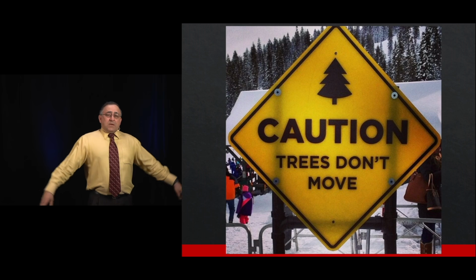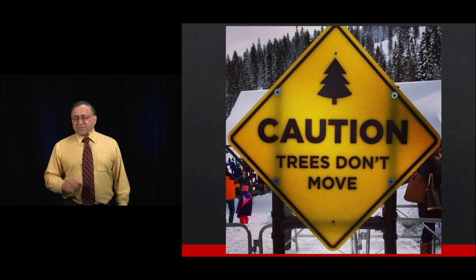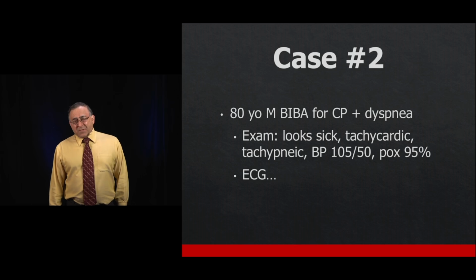All right, take a deep breath in, mental break here. Talked a lot about pericarditis for the past 40 minutes. Let's talk about a couple more things. These are quick hitters. Here's an 80-year-old brought in by ambulance. That's what BIBA stands for.